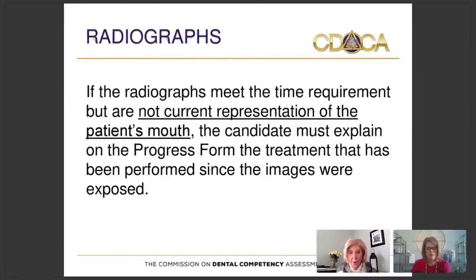Another requirement of these radiographs is that they are a depiction of the current condition of the patient's mouth. But if these radiographs are not, then you must explain this on the progress form. What may have happened is the radiographs may have been exposed 2 years ago. The patient has had an extraction, has had some additional fillings, whatever the dental treatment.